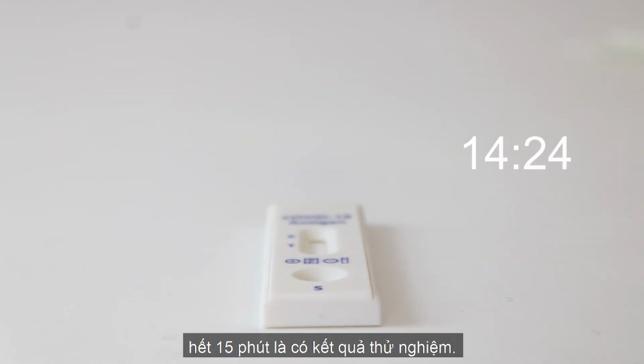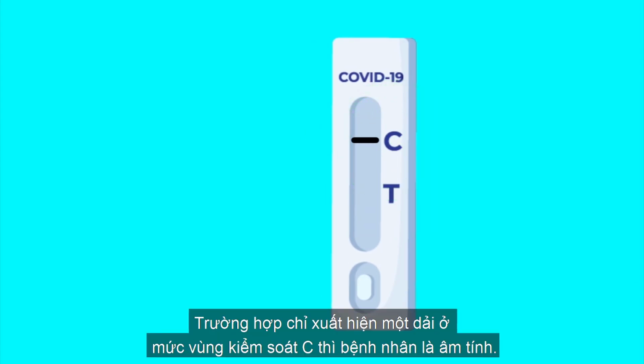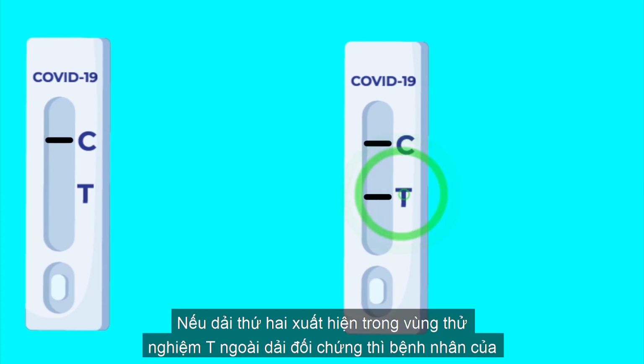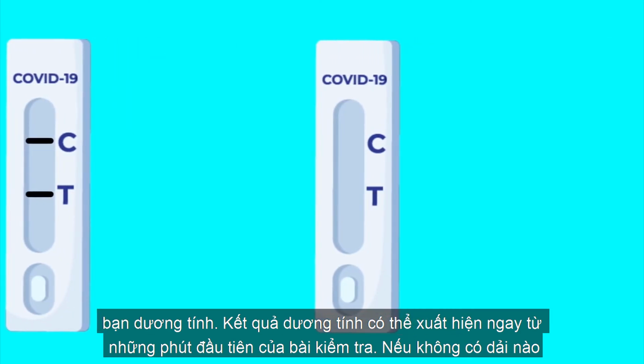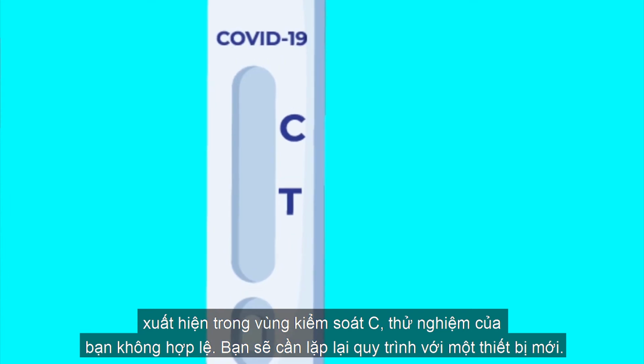At the end of the 15 minutes, the test results are available. If only one band appears at the level of control zone C, then the patient is negative. If a second band appears in the T test zone in addition to the control band, then your patient is positive. Positive results can appear from the first minutes of the test. If no band appears in area C, your test is invalid. You will need to repeat the procedure with a new device.